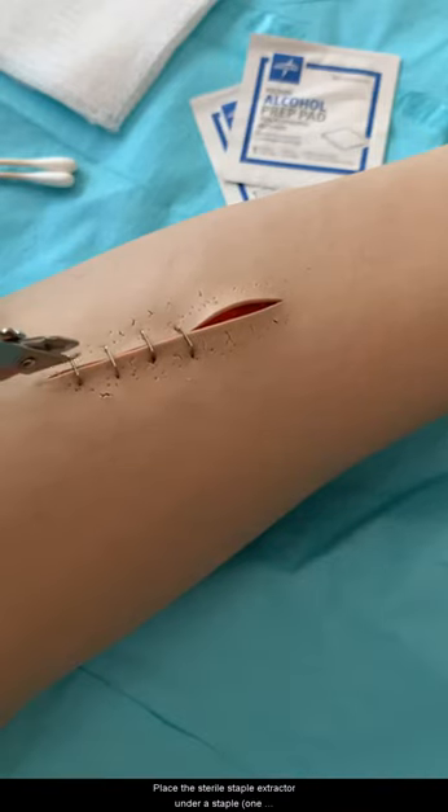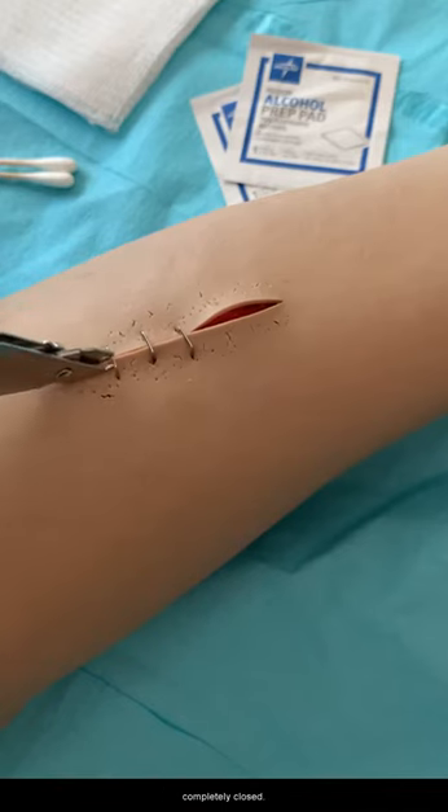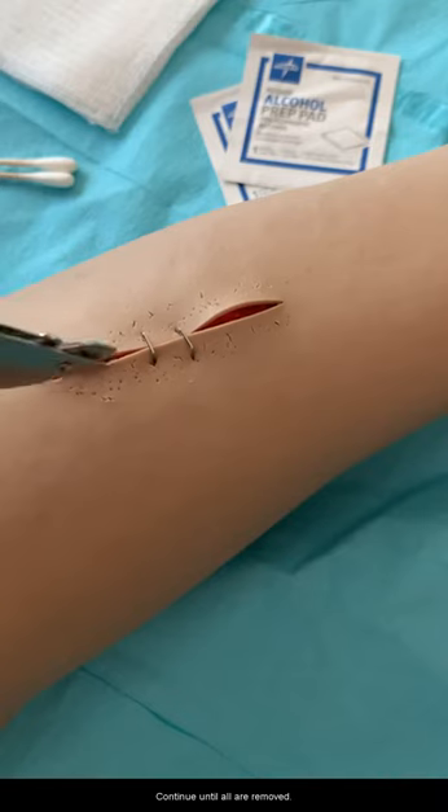Place the sterile staple extractor under a staple, one at a time, and squeeze the handles of the extractor completely closed. Lift the staple away from the skin and dispose in a sharps container. Continue until all are removed.